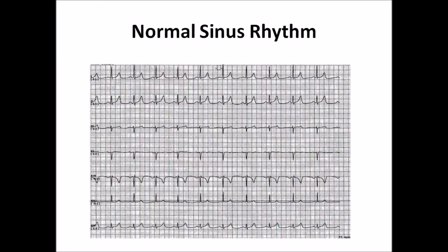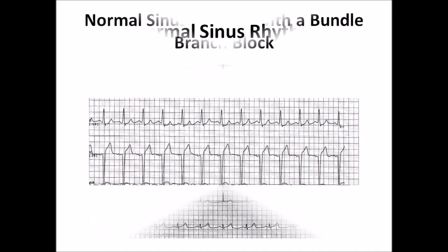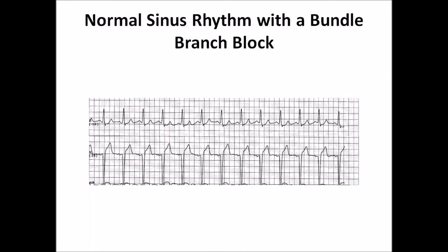This is the full disclosure view of a patient on telemetry, showing all limb leads 1, 2, 3, AVR, AVL, AVF, and V. The P wave has a sinus node morphology, being upright in leads 1, 2, and AVF, and inverted in AVR. In EKG rhythm tests, the leads commonly used are lead 2 and V1. This is sinus rhythm with bundle branch block.